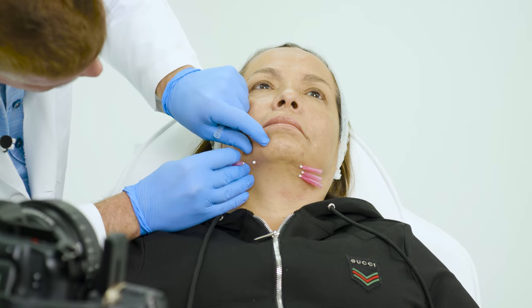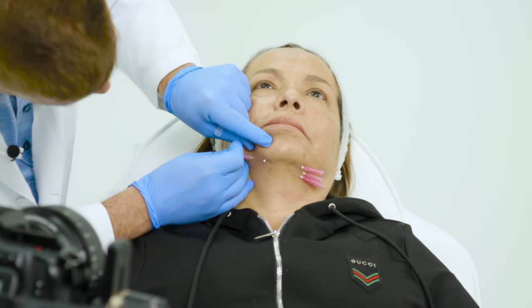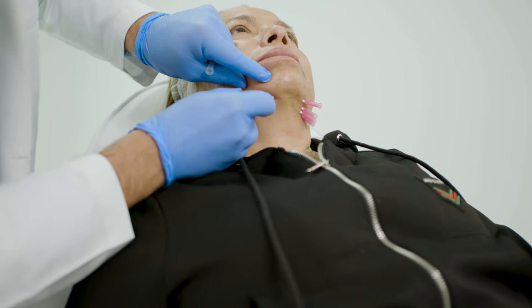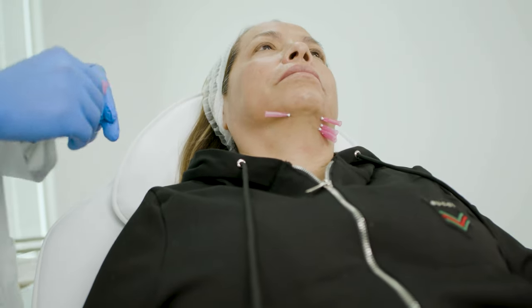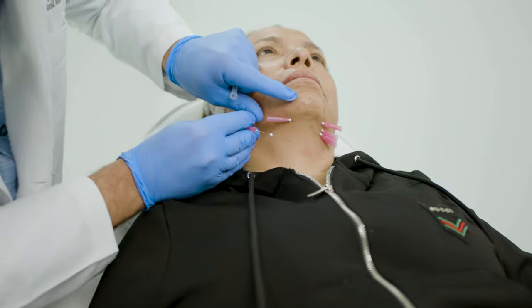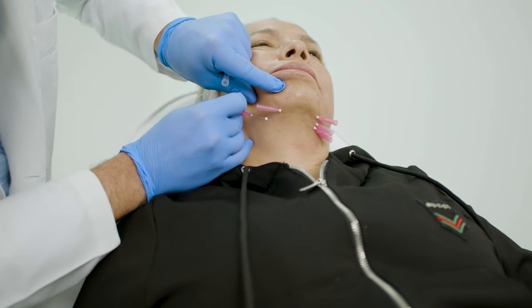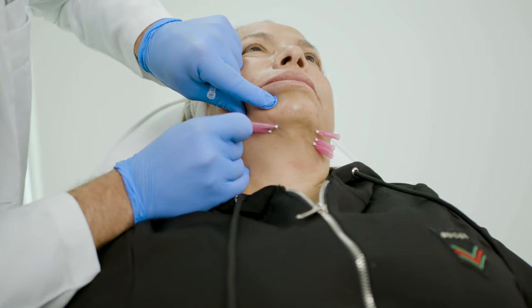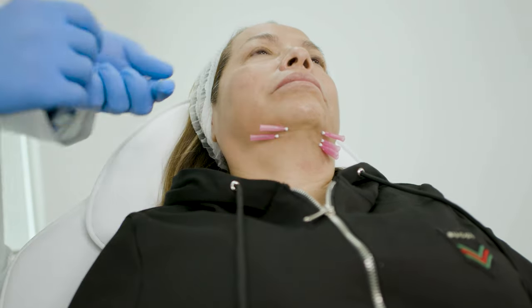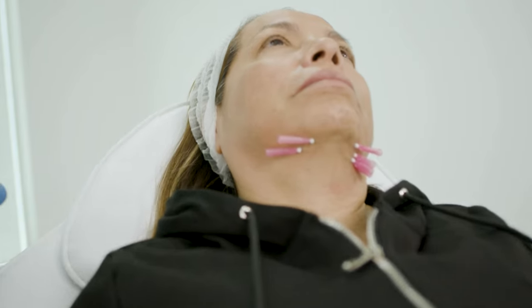This treatment would typically cost somewhere around $600 in my practice. You need to check your local market to see what you could charge in your area, but around $600. The cost for the monofilament threads is pretty cheap — somewhere around $50, depending on which company you use. If you work with a company that has a relatively reasonable cost of PDO threads, you'll have a very great markup on this.